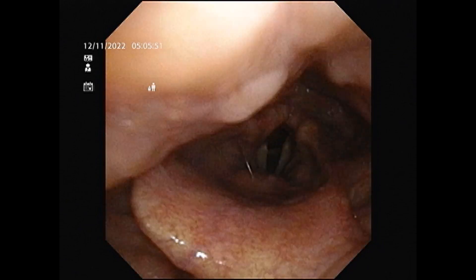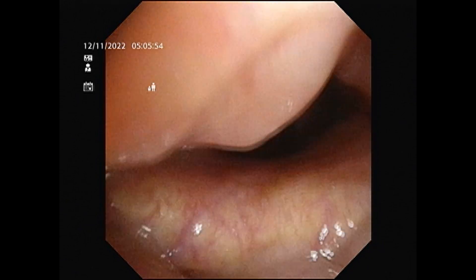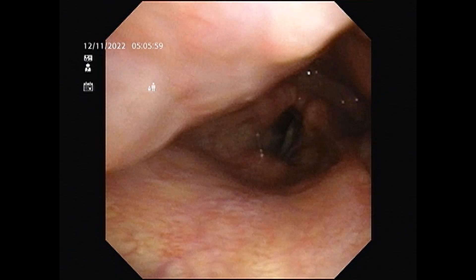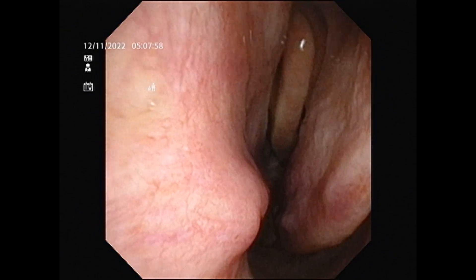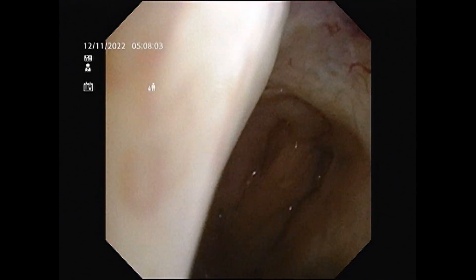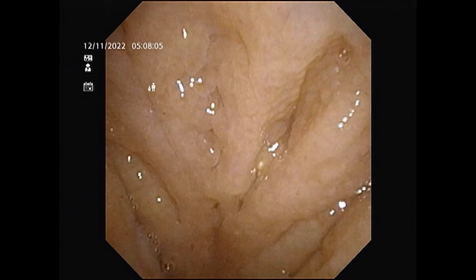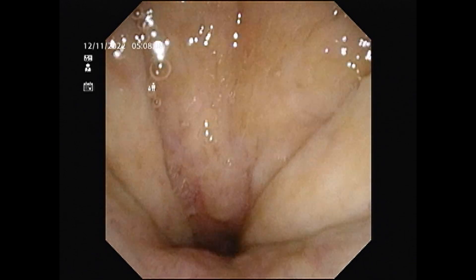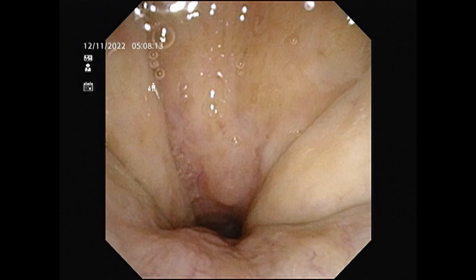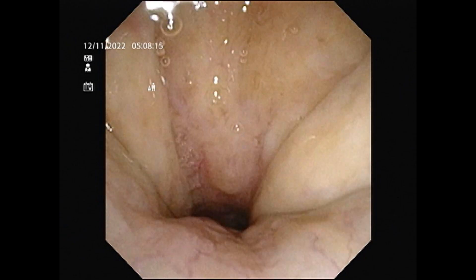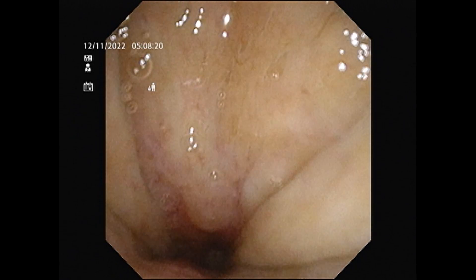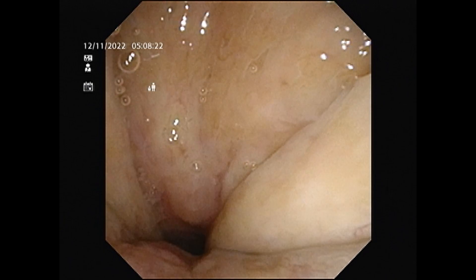When I am trying to put my endoscope further beyond that constricted narrow part, you can still see the amount of vibrations happening. These vibrations are the reason why the patients snore — the sound of snoring is because of all these vibrations touching and hitting each other. Again, I am going to put the endoscope in the patient's left side nose pointing downwards. You can actually see the vibrations and those vibrations are giving the effect of snoring.